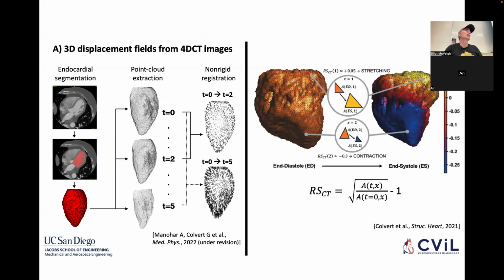It was really, people did it with different levels of skill, depending on whether they were motivated or not, so we got variable results. Then we used all that hand data to train the deep learning network. When we went into the training, we looked for the Dice scores of individual hearts that were poor, which indicated that the segmentation of the CNN had failed. We brought up all those cases, and when we looked at them, in 90% of those cases, it wasn't the segmentation of the CNN that had failed.